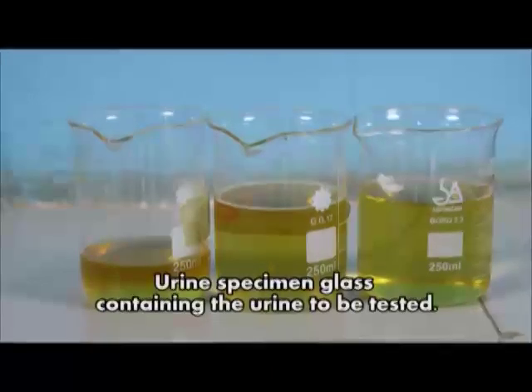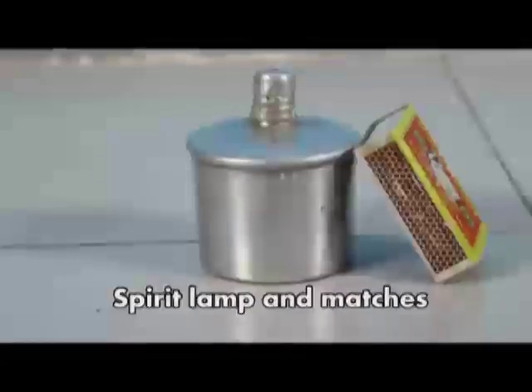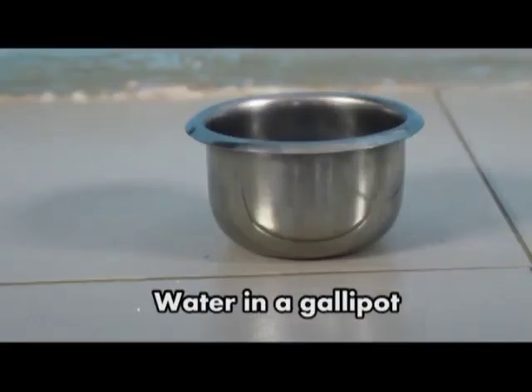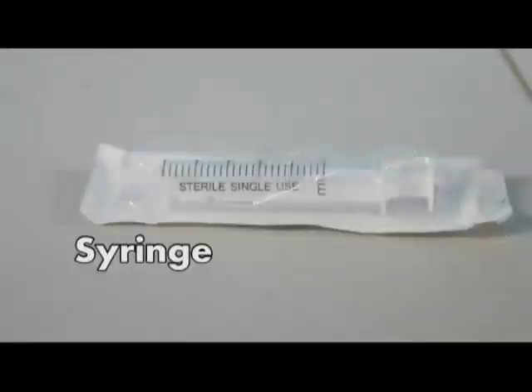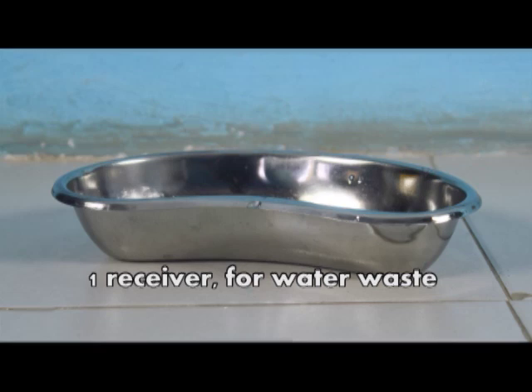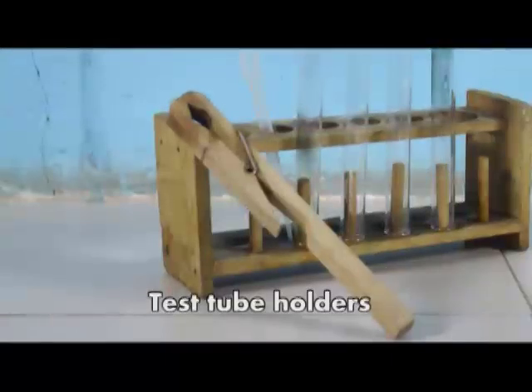Requirements for testing urine: urine specimen glass containing the urine to be tested, test tube and rack, spirit lamp and matches, water in a gallipot, dropper or pipette, syringe of appropriate size, one receiver for water waste, bin to discard other materials, test tube holders.